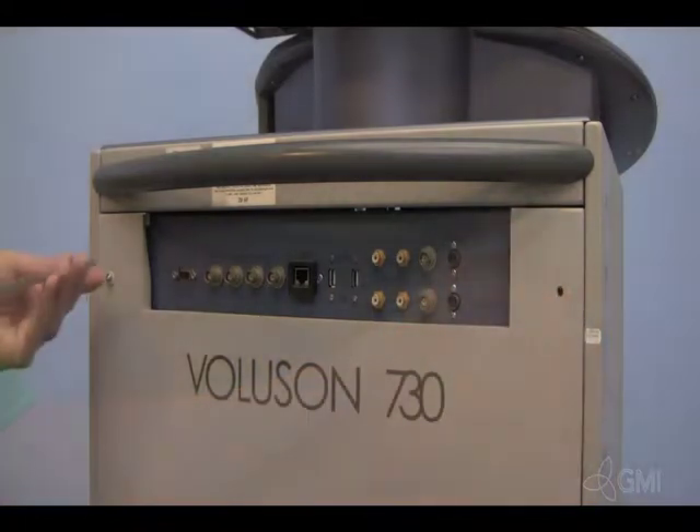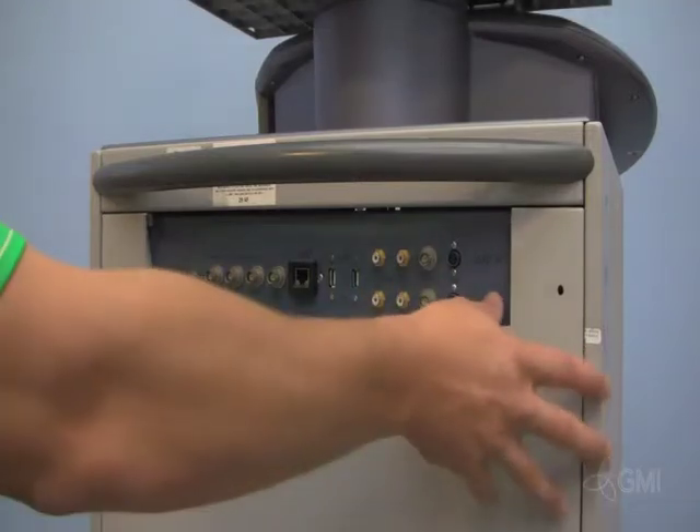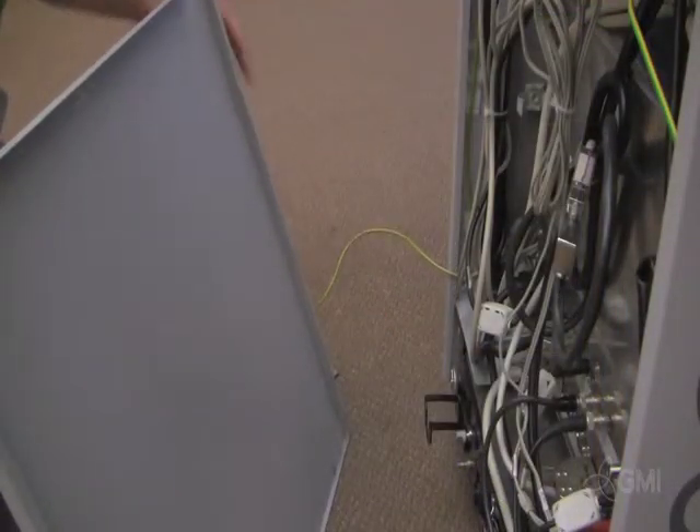Start with the system off and unplugged. Remove the two screws securing the rear panel. Remove the rear cover by leaning out from the top and lifting up. Disconnect the ground cable from the rear panel.